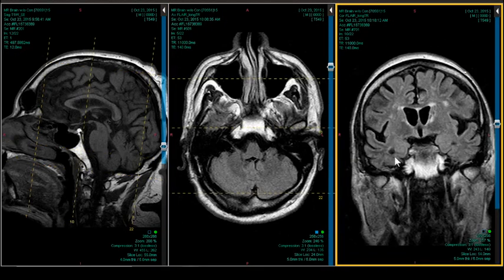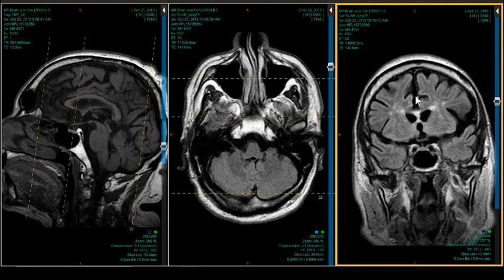If it's not temporally avid, if it doesn't like the temporo-occipital region, as in MS, and patients are in the wrong age group, they don't have signs of MS. I don't put MS in my discussion. I never say can't rule out and then go through this long liturgy of white matter disorders. That's crazy. First of all, white matter disease like this doesn't occur in Japanese men, or it occurs very sparsely in Japanese men, and it's because of their diet.